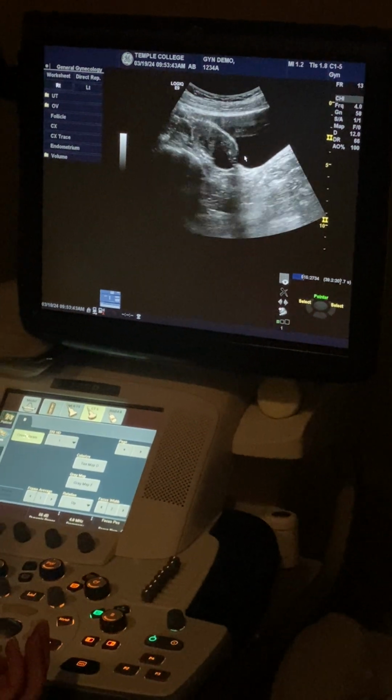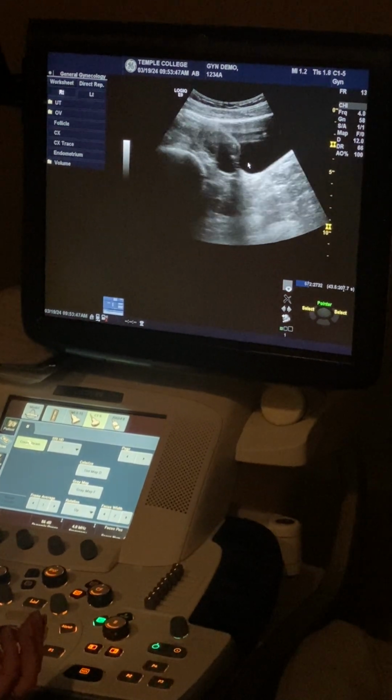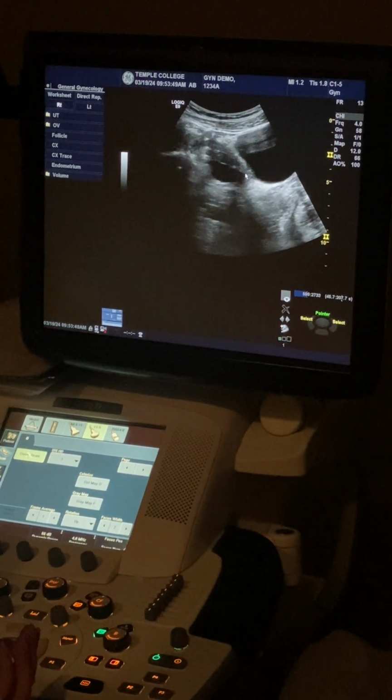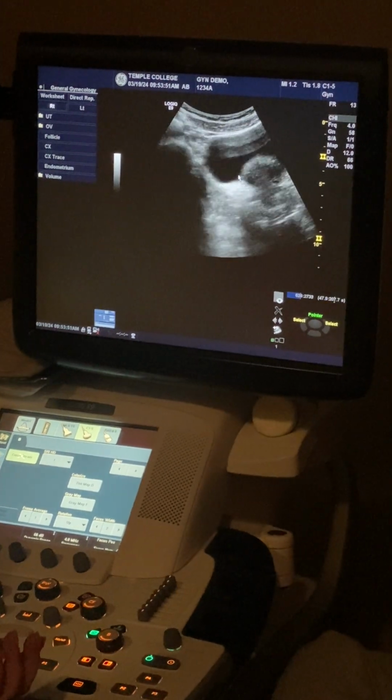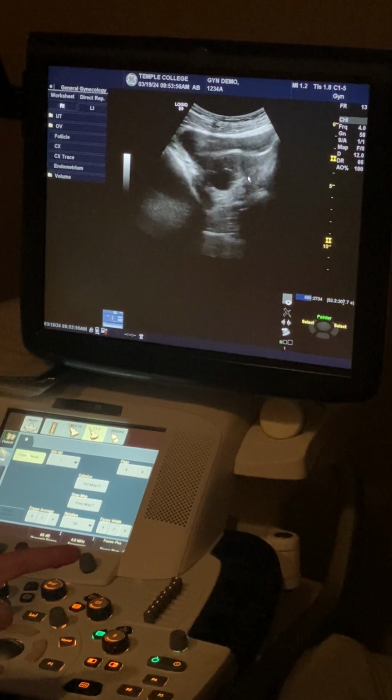Yeah. And again, just gonna turn until it looks long. I'm twisting on it. So now I'm kind of getting more trans. And I'm going to use that bladder, so I'm going to actually come from the left and angle towards the right.